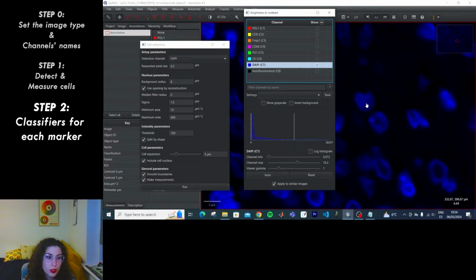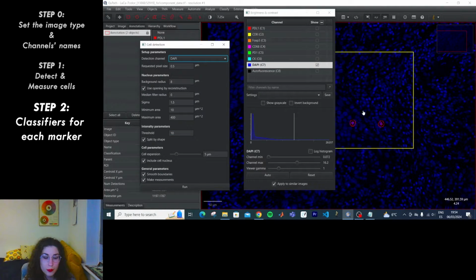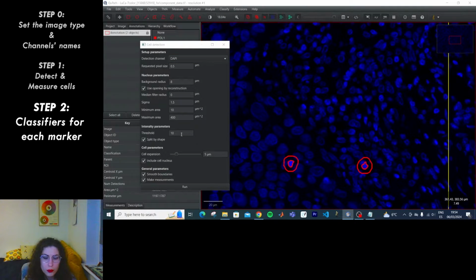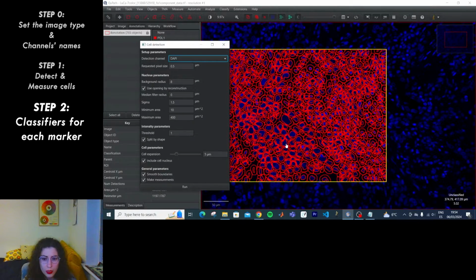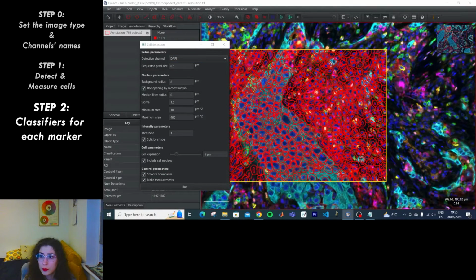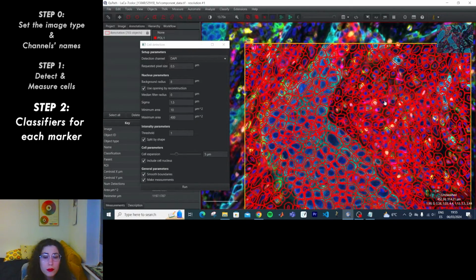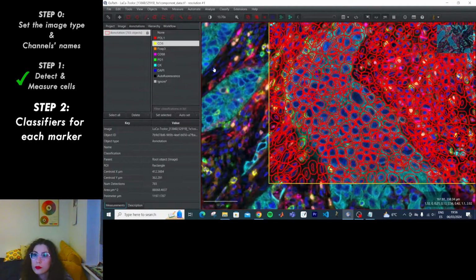Yes, probably this. 10? Not well. Okay, then. Okay, I think this is right. Yep, looks alright. Okay, cell detection done.